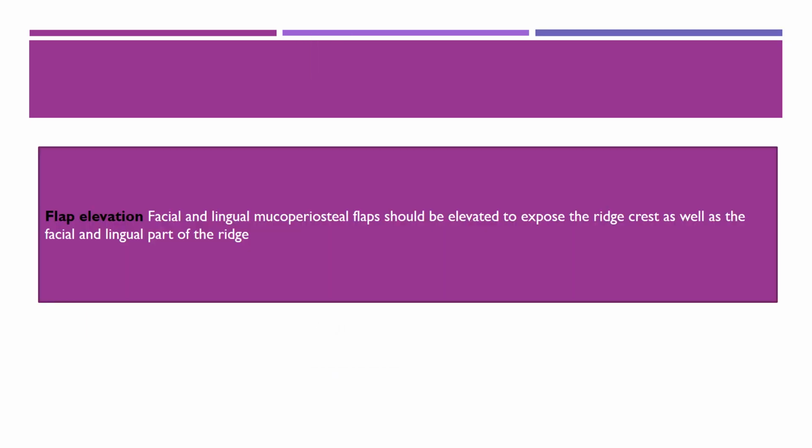Then coming to the flap elevation. So facial and lingual mucoperiosteal flaps should be elevated to expose the ridge crest as well as the facial and lingual aspects of the ridge. So by flap elevation, if we are not going for flapless implant placement, we will be going for the flap placement. So we will be clearly evaluating the bone morphology by reflecting the flap.